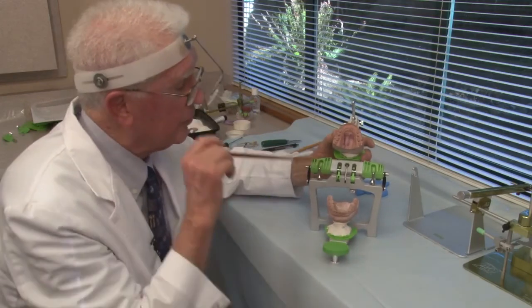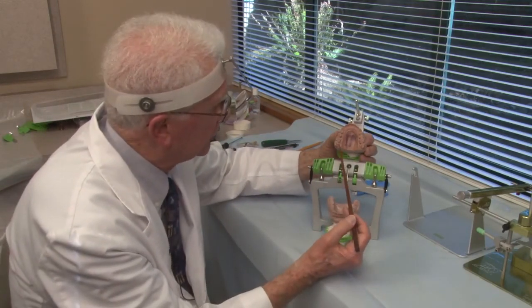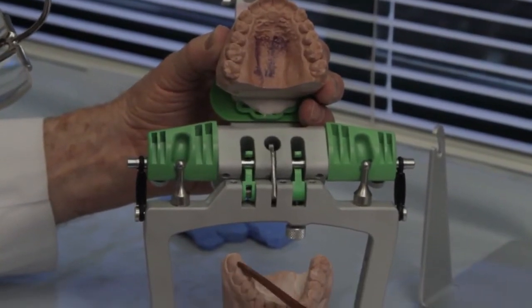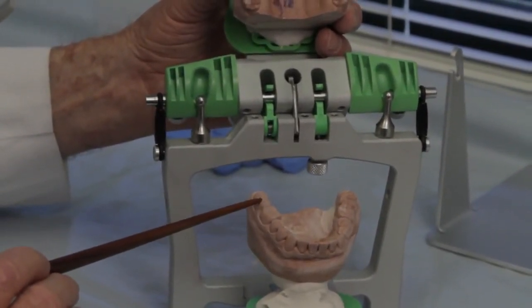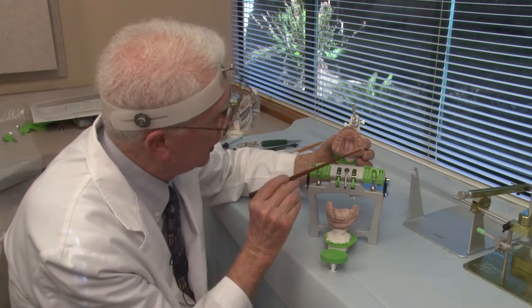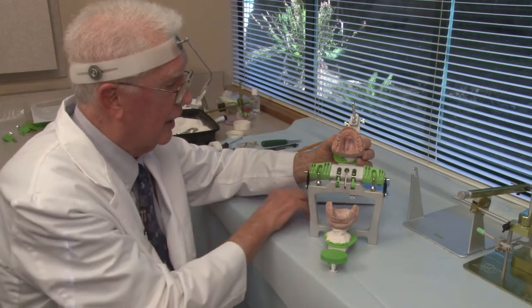Now then, if we look at the occlusal surface of the upper teeth, you can see a green mark here and here. So we're on the first molar and the most posterior tooth here. And then we look at all the rest of the teeth, and there are no marks at all. So the only contact is on the right side.